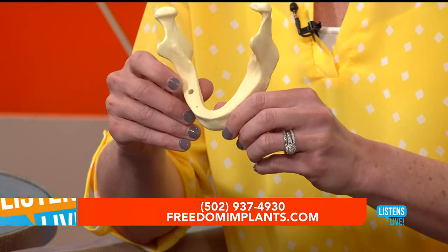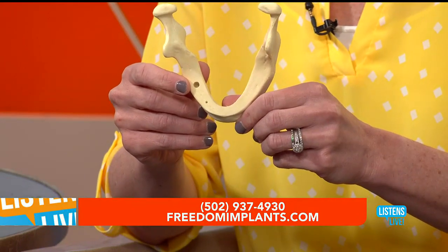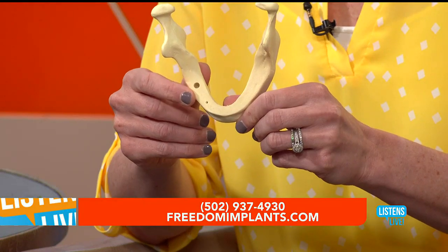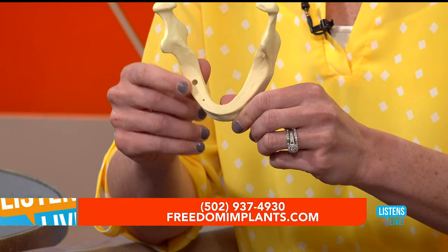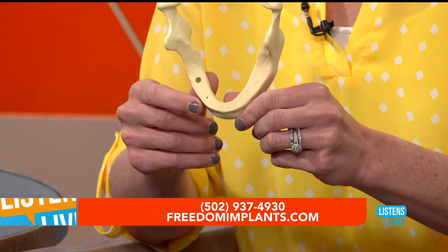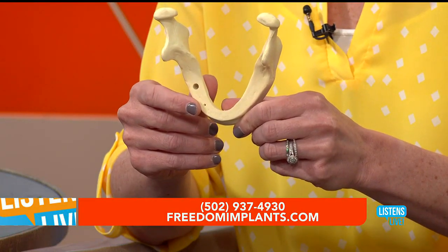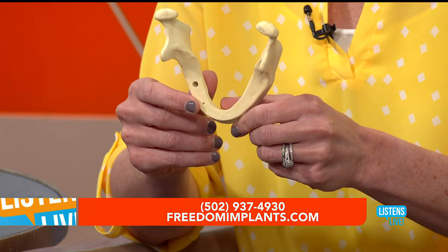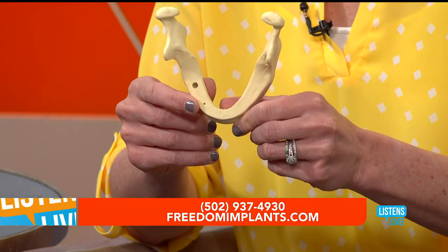So a lot less invasive than the big hole here. That's kind of the size of a surgical traditional implant. So they have to have a lot more bone. They usually make an incision. Usually it has to heal up, another 3 to 6 months before you can even use it. So versus the little hole, that's the amount of the hole that I have to make to place an implant. So I don't have to have much bone, just some bone, to be a candidate for the mini implant.